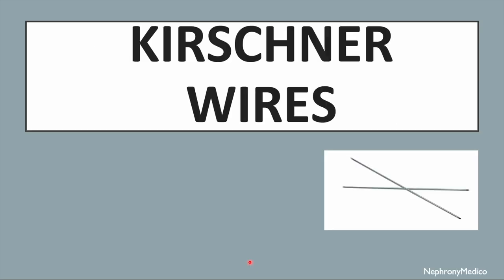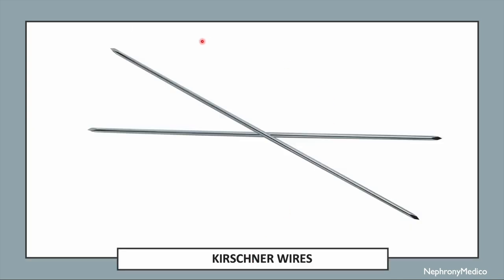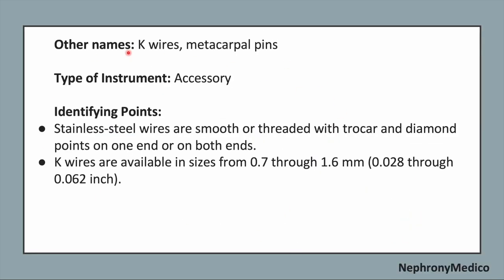Let's talk about Kirschner wires. This is a picture showing Kirschner wires. Now, the other name of this instrument is K-wires or metacarpal pins. It is an accessory type of instrument.